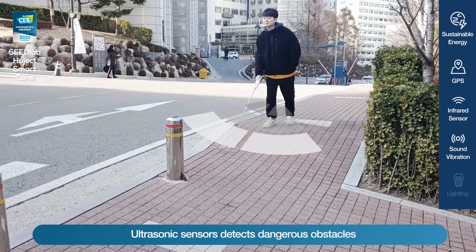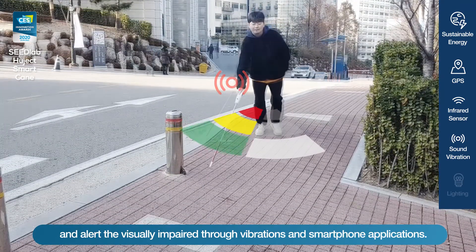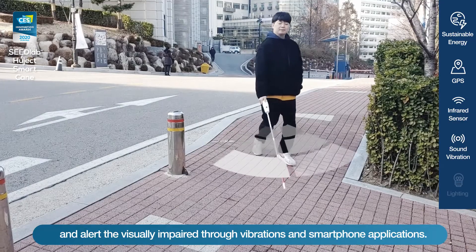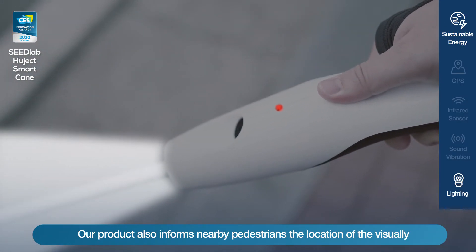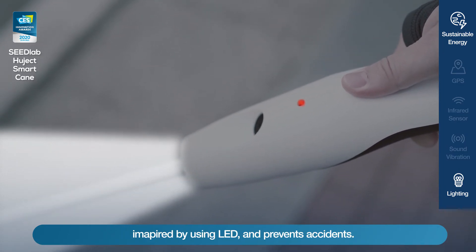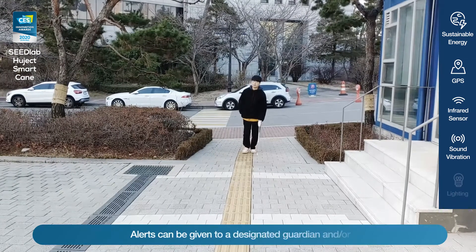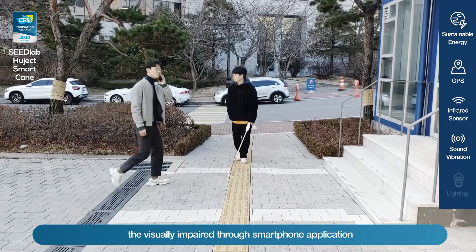Ultrasonic sensors detect dangerous obstacles and alert the visually impaired through vibrations and smartphone applications. The product also informs nearby pedestrians of the location of the visually impaired by using LED lighting, helping to prevent accidents.